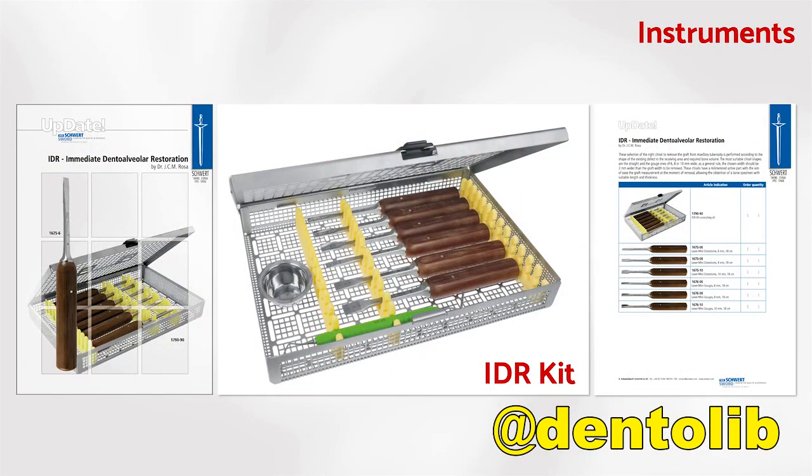And here you can see the IDR kit. Inside this box, you have 6 chisels. These 6 chisels are 6, 8, and 10 millimeters wide. 3 of them are straight, and 3 of them are gouge-shaped. Inside this box, we also have a bone compactor made of titanium and a container to insert the graft as soon as the graft is taken from the maxillary tuberosity.